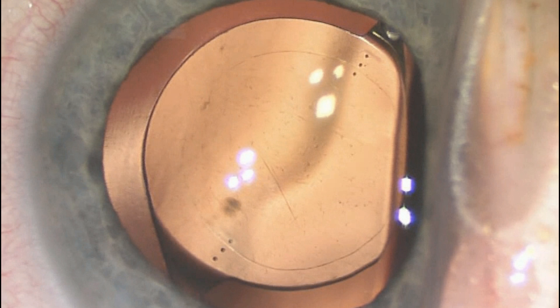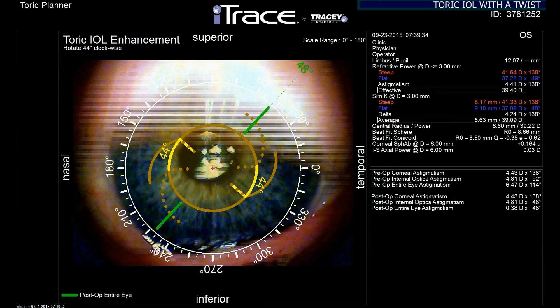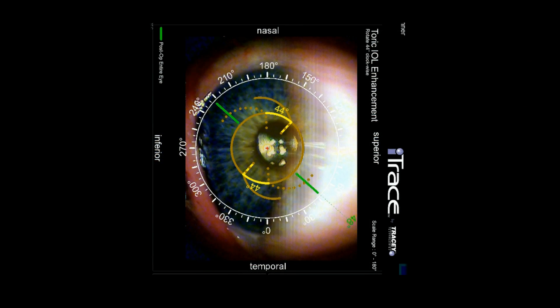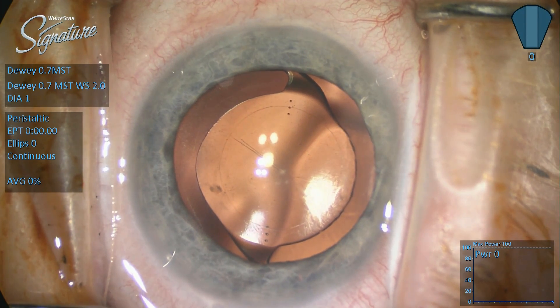Twice now we've gotten this IOL to look this good, positioned within the confines of the capsular bag and aligned with the toric alignment marks on the cornea. This is the second time in the eye. Eye trace calculations tell me that if I rotate the lens 44 degrees, I'm going to correct 5.24 diopters of cylinder. So we take this toric alignment planning map created by the eye trace, rotate it so the temporal aspect is appropriate, tape it to the microscope, and get going.